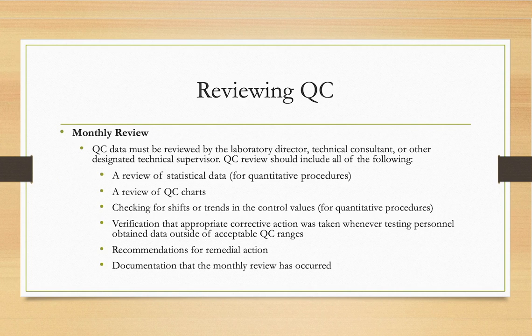Monthly review. Quality control data must be reviewed by the laboratory director, technical consultant, or other designated technical supervisor. Quality control review should include all the following: a review of statistical data, that is, for quantitative procedures.